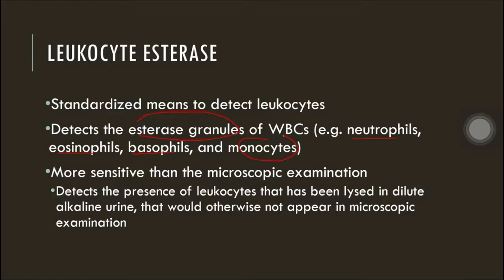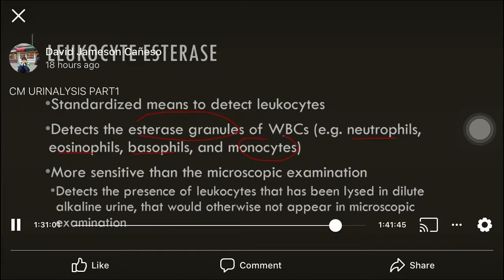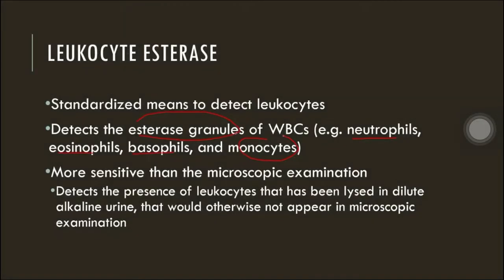Okay, so with that said, since the leukocyte esterase is trying to detect the presence of granules, not the concentration or number of WBCs itself, it is more sensitive than the microscopic examination. Aside from that, ano pa yung reason kung bakit naging mas sensitive si LE kaysa sa microscopic? Okay, kasi there are conditions that may cause the medical technologist or the laboratorian to miss the WBCs in the microscopic examination. So for example, yung specimen, dilute alkaline urine. So if you try to remember earlier in changes in unpreserved urine, WBCs, RBCs, and casts may be decreased in a dilute alkaline urine specimen. Okay, so that happens, yung dilute alkaline urine specimen usually nangyayari kapag improperly preserved or unpreserved yung specimen.